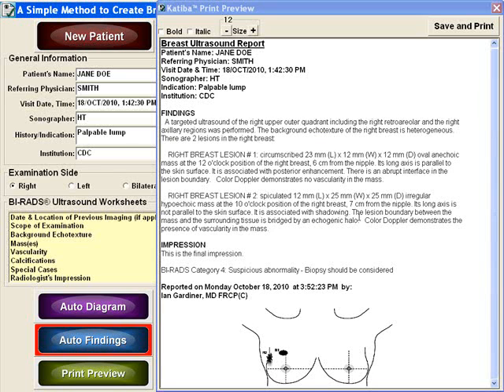The Auto Findings button will automatically create a structured report based on the selected descriptors. The radiologist can still edit the report at this point. This template can be customized to include the institution's logo and address, plus the radiologist's signature.